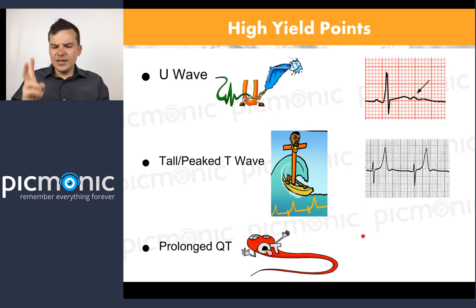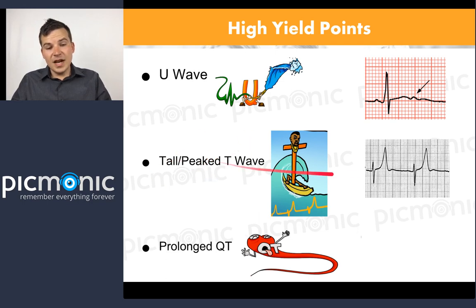Those are two that are so commonly tested. Also, if you have a patient who's fidgeting or twitching out of control and they're having problems and they're a renal patient, you're going to see the tall peaked T wave on the ECG and you're like, wow, that person may have hyperkalemia. Look how tall that T wave is. That's crazy. And of course, then you can treat that. But remember that potassium affects the cardiac system a lot. The heart is very sensitive to those imbalances. That's why we can see it on the ECG, and of course it causes arrhythmias very easily.